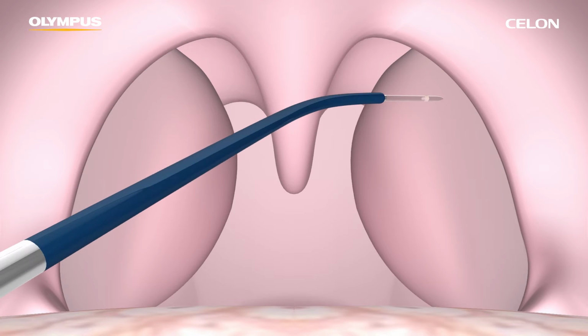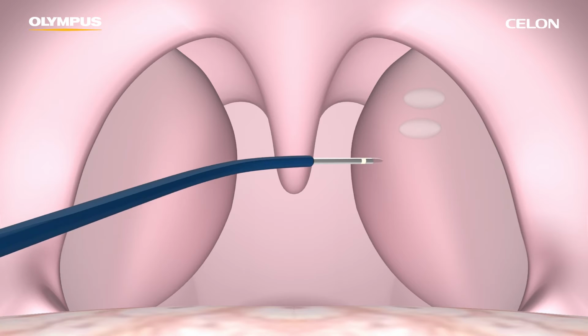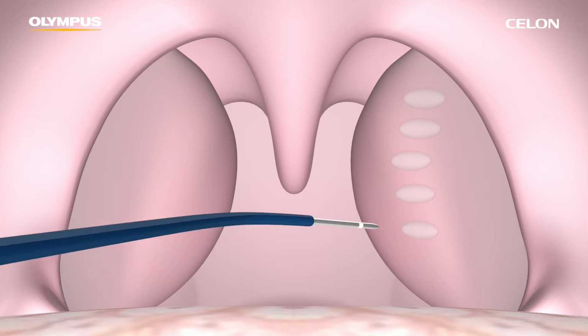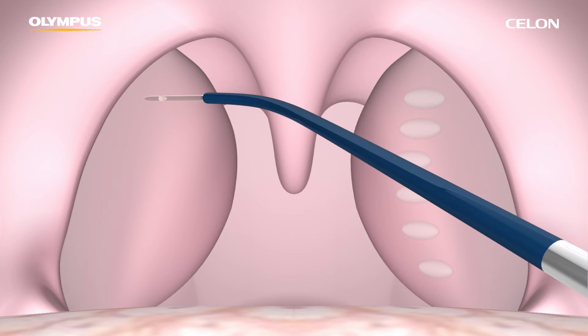The points of insertion should be approximately 1 centimeter apart. The number of insertions required depends on the size of the tonsils. 4 to 6 punctures are normally necessary. A little blanching may occur, but this is normal and not a reason to stop the coagulation.